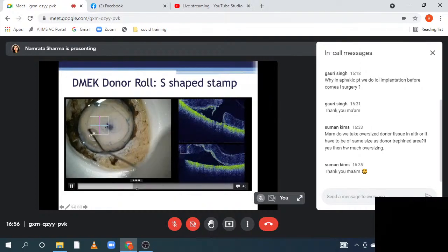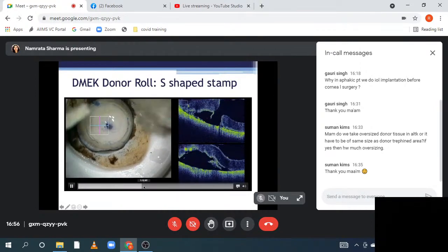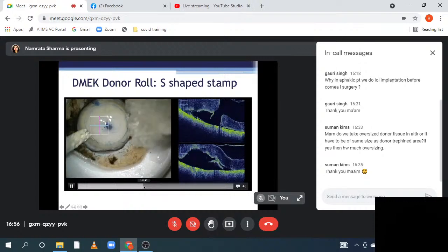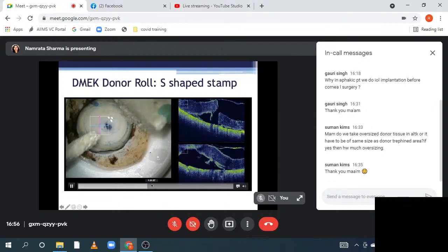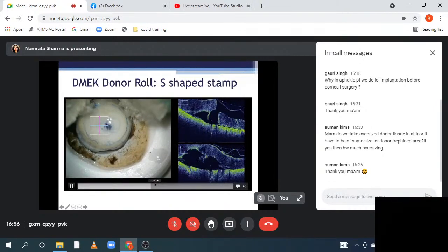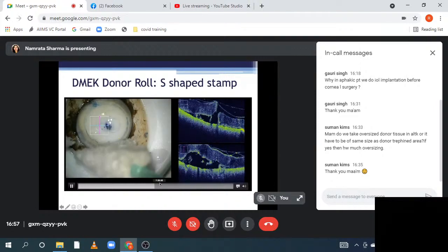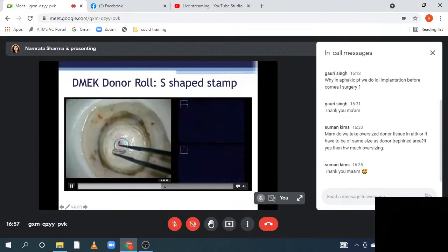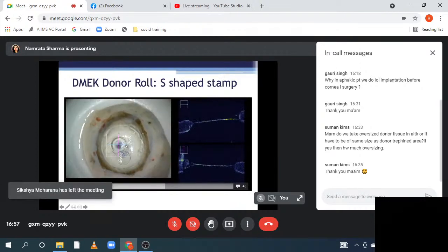So after you lay it back, the corneoscleral rim is then flipped on the other side. This is laid back. One has to be very careful because the Descemet's membrane is so fragile. The moment you allow too much of fluid, it starts to misbehave because it gets sucked in by the capillary action. So you dry it completely, flip this, and because you've trephinated it earlier, you have this lid. Beautiful, it looks like a Descemetocele there.